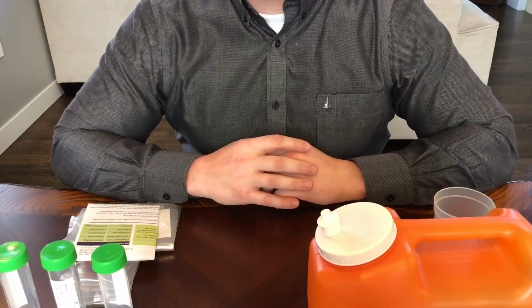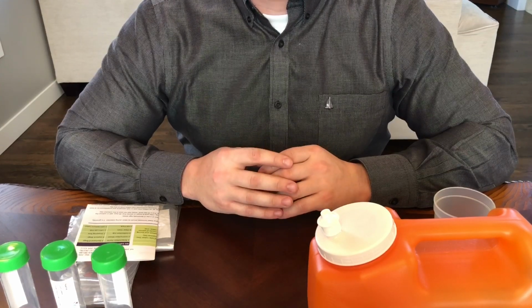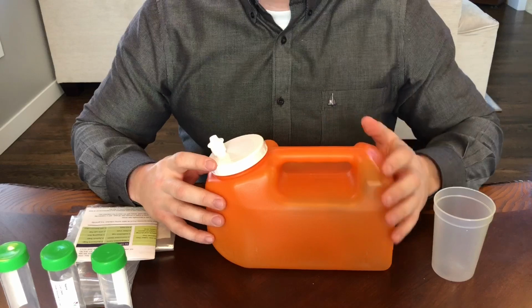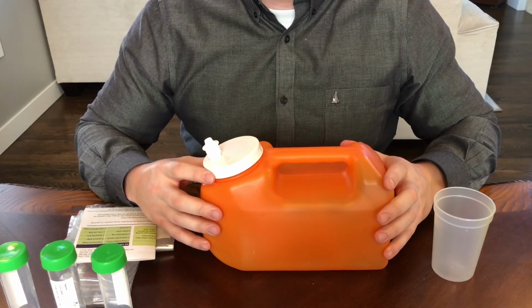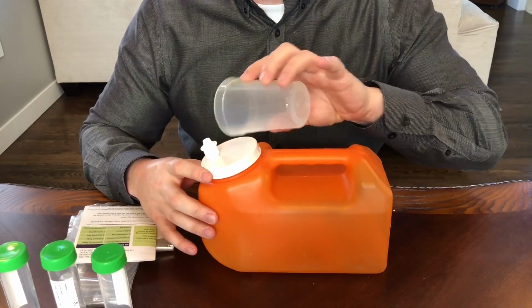On the morning of collection, discard your first urination into the toilet. Record this time. For the next 24 hours, you're going to want to collect all urinations into the jug. You could either urinate directly into the jug or go into the provided cup and pour it into the jug.